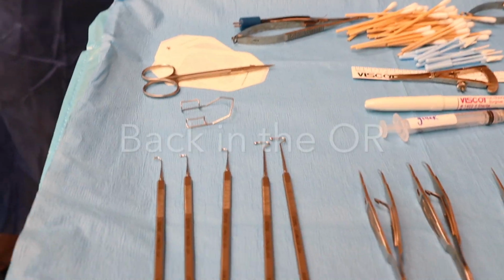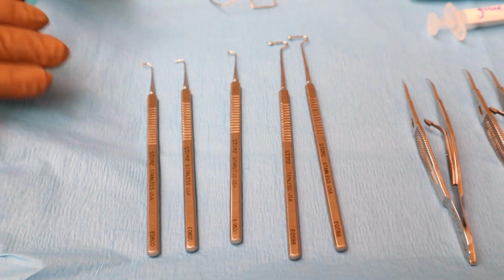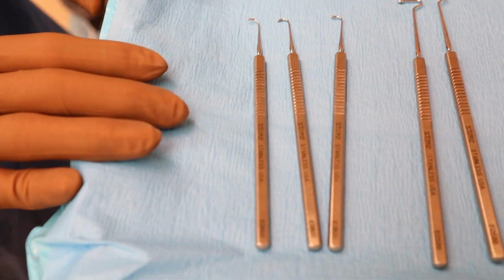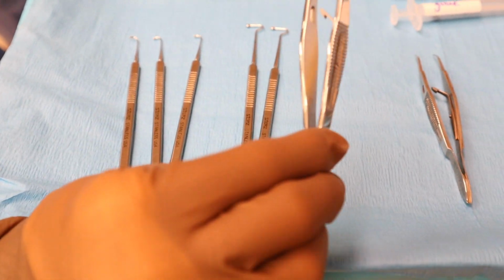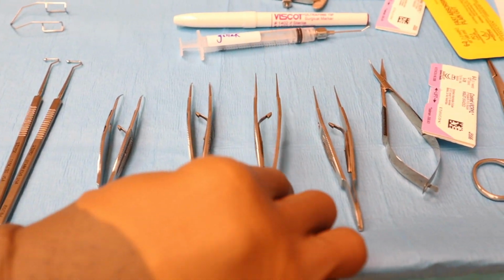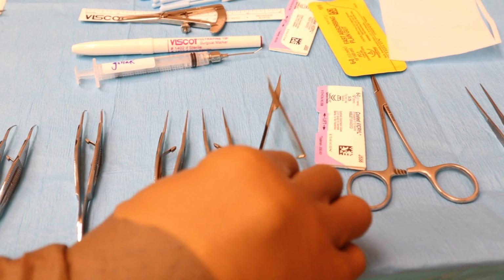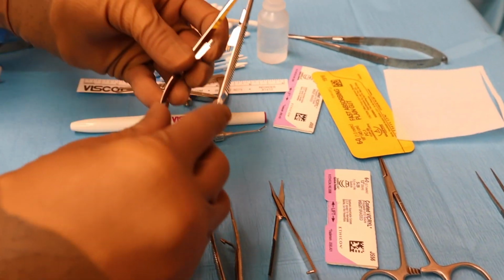This is good. Yeah. So these are our instruments for strabismus surgery. Right there we have the small hooks, then the Jameson hooks. I like everything oriented the same way. Those are the Moody forceps I use to move the eye around. The straight forceps, needle drivers. Westcott. Oh, so those are Westcott, sorry, I can't even see. Those are the Westcotts, which are the scissors basically.